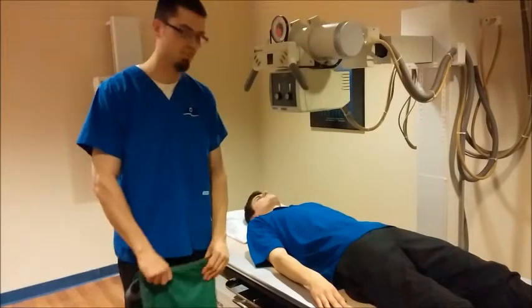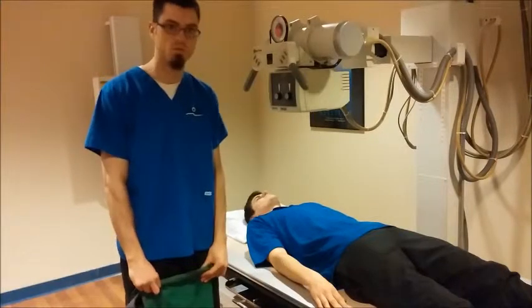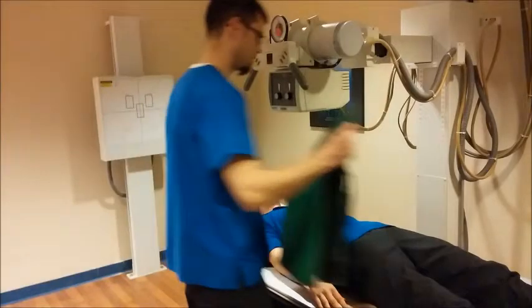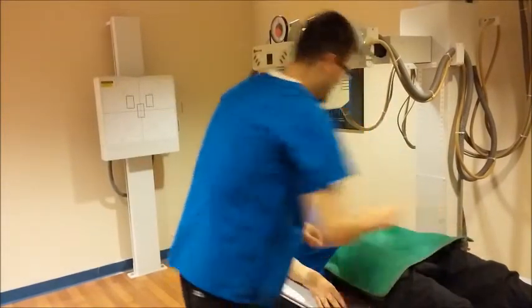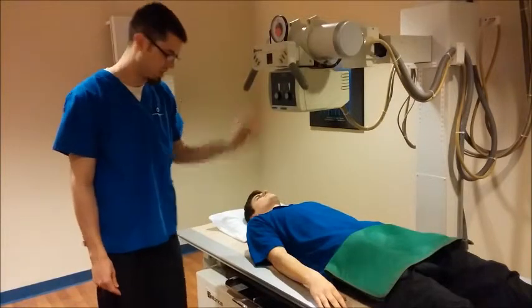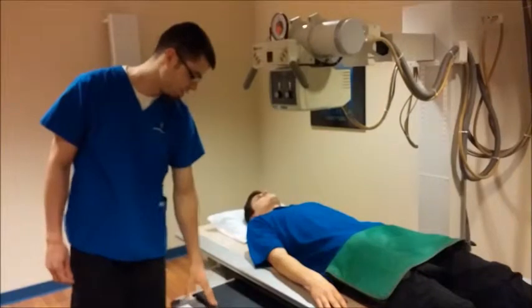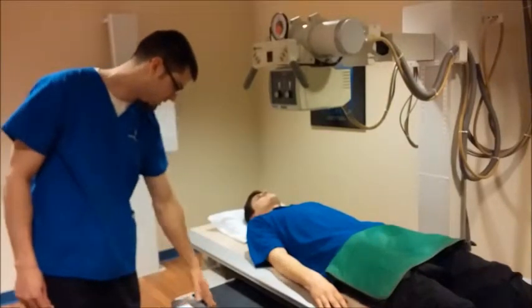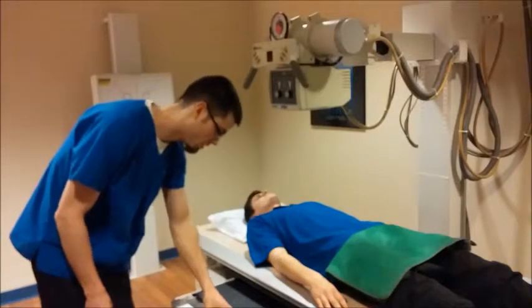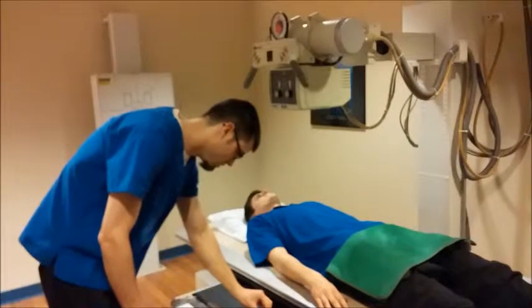The second projection that I will be demonstrating is the supine X-ray for the scoliosis screening. First thing I'm going to do is shield the patient's gonads. And this projection is done with a 40-inch SID. And for this, we'll be using a 14 by 17 cassette, lengthwise, same as the erect. And we will take a right marker this time and put it in the lower left side of the cassette, about 4 inches in, again, for the same reasons.